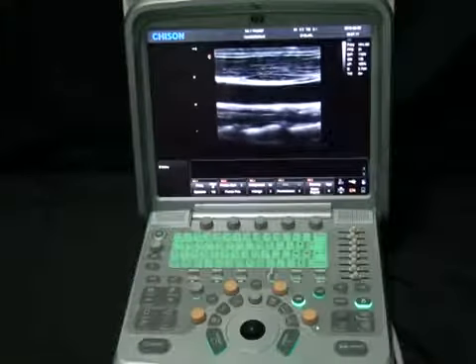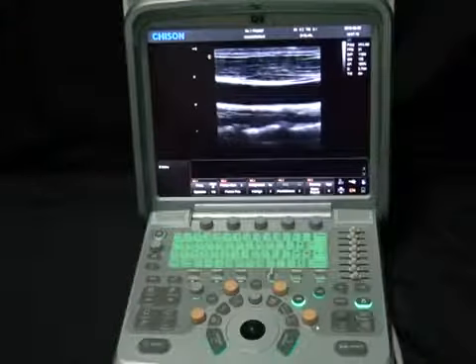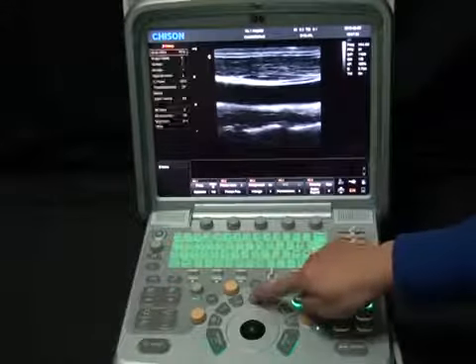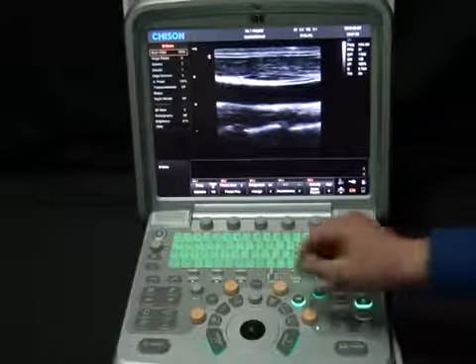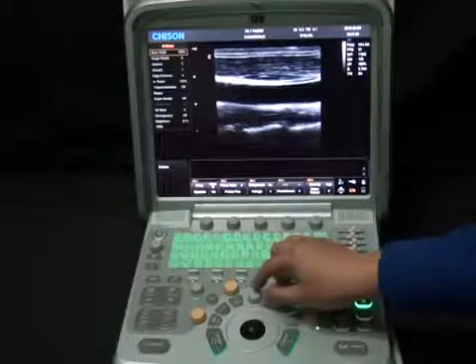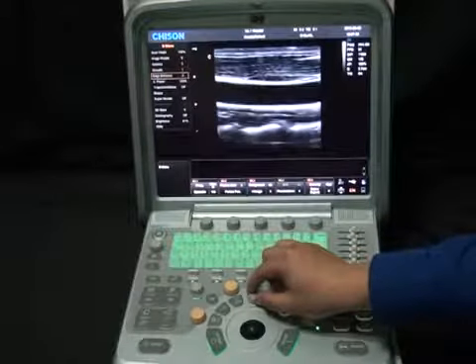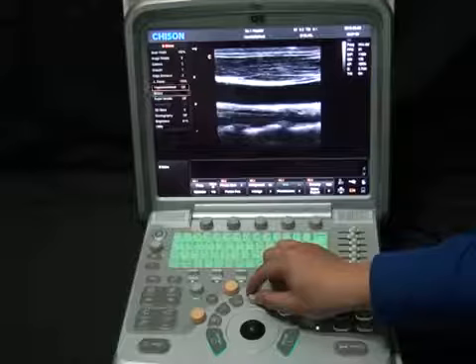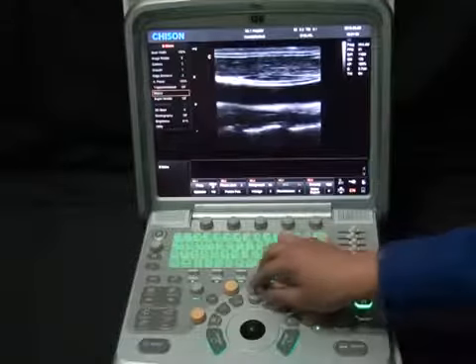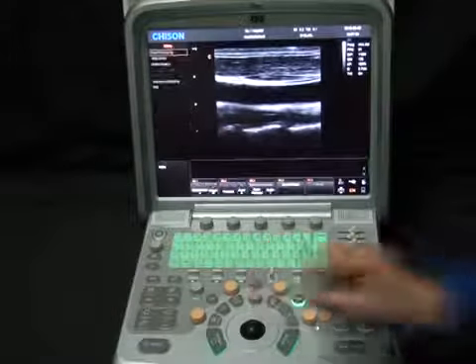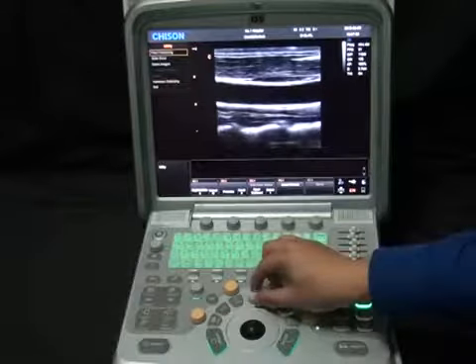We have secondary image optimization controls by pushing down the menu button. On the top-left side of the screen, several other parameters are available. Biopsy will give the biopsy guide, and we have the utility menu below. When we are done, press exit.